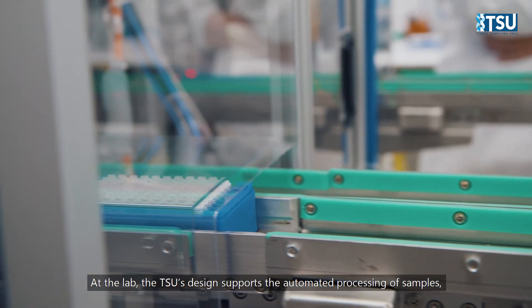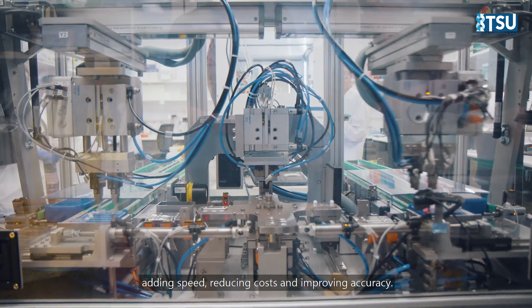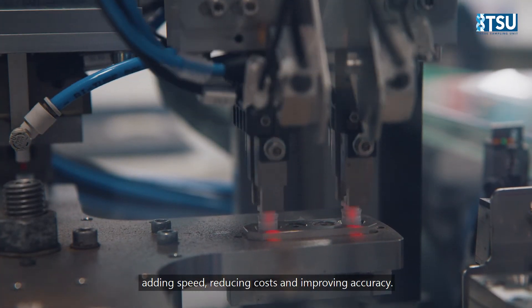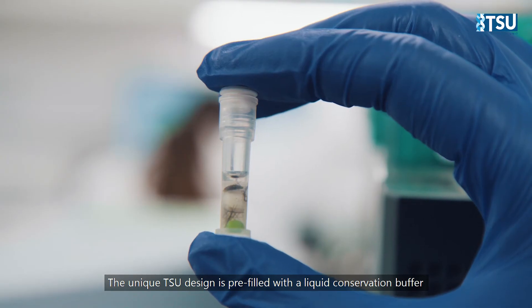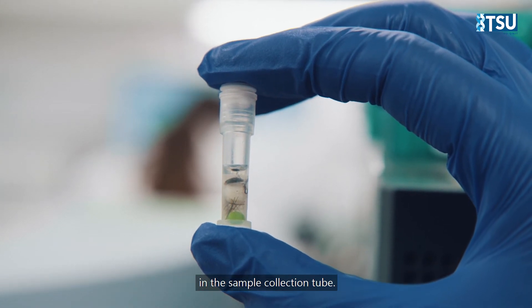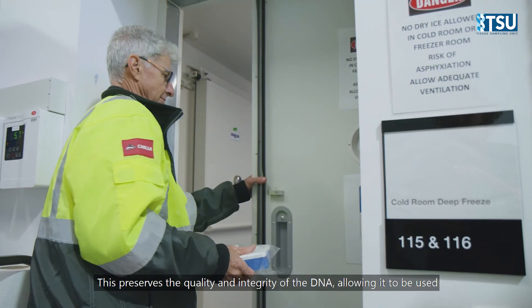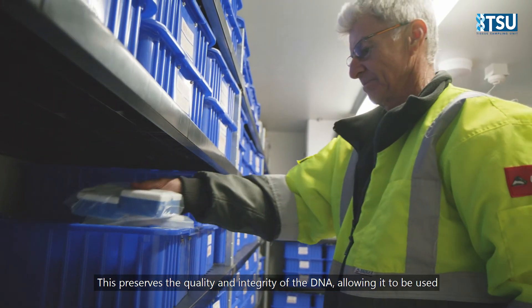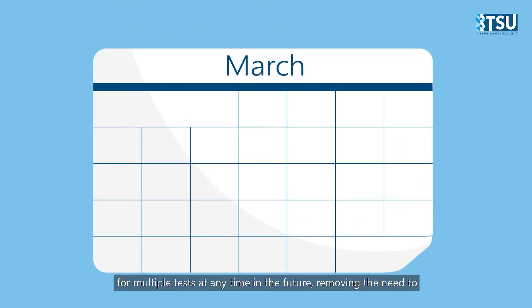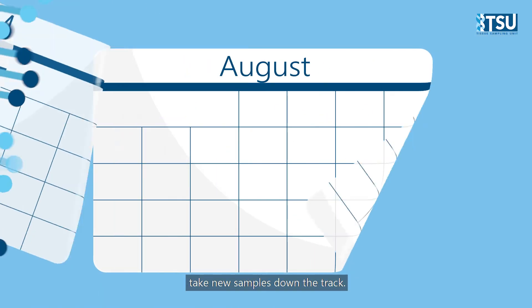At the lab, the TSU's design supports the automated processing of samples, adding speed, reducing costs and improving accuracy. The unique TSU design is pre-filled with a liquid conservation buffer in the sample collection tube. This preserves the quality and integrity of the DNA, allowing it to be used for multiple tests at any time in the future, removing the need to take new samples down the track.